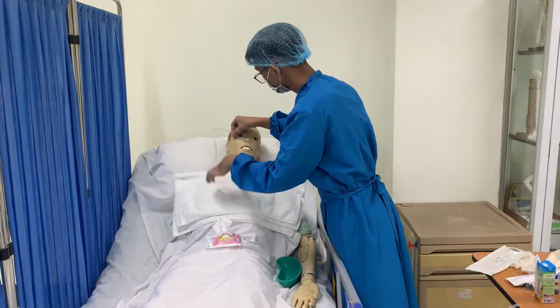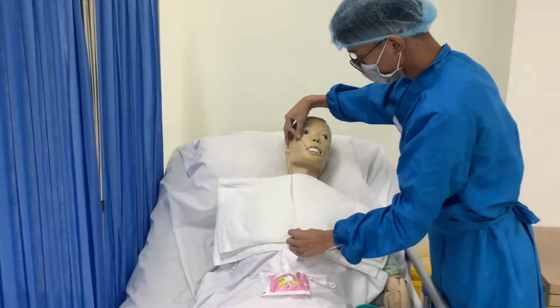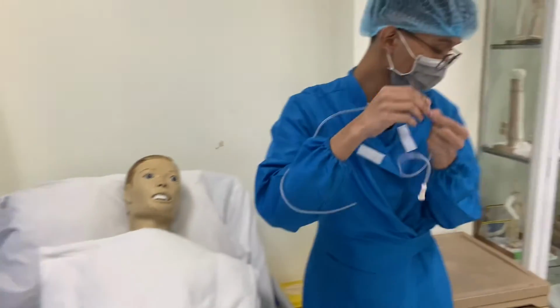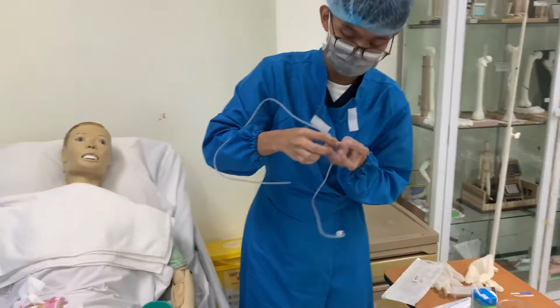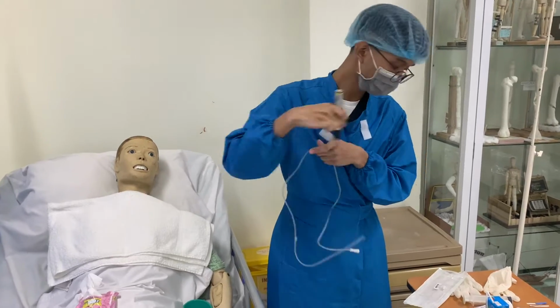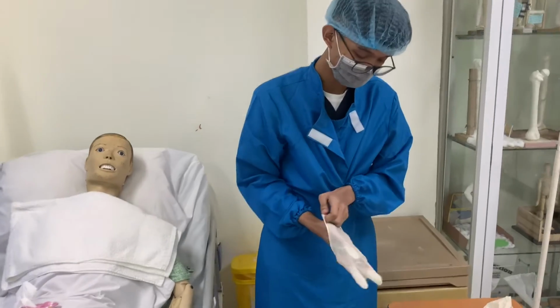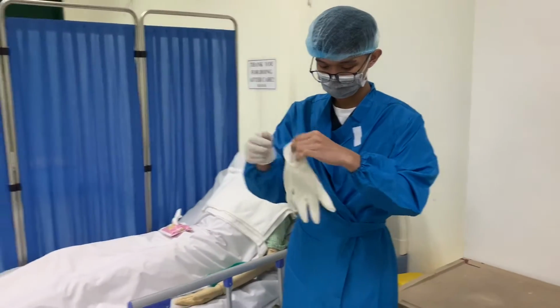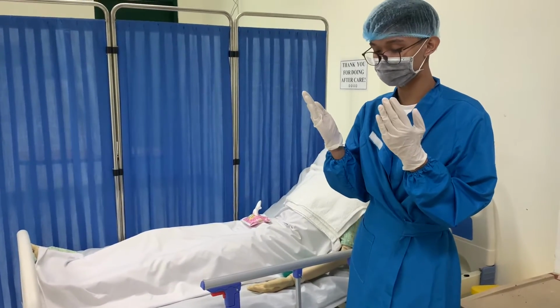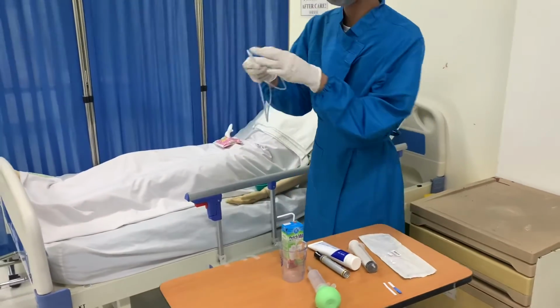Measure the distance to insert the tube by placing the tip of the tube at the patient's nostril and extending it to the earlobe and then to the tip of the xiphoid process. Mark the tube with an indelible marker. Put on gloves. Lubricate the tip of the tube at least 2 to 4 inches with water-soluble lubricant. Apply topical anesthetic to the nostril and oropharynx as appropriate.